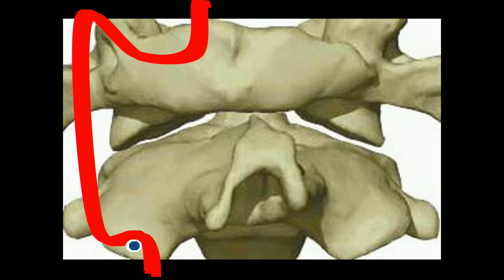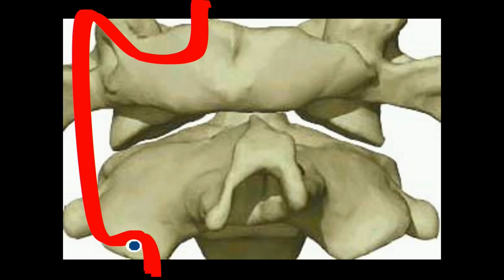That's the pars screw. Well, you're going to say, well, that pars screw is sitting right next to where the vertebral takes a turn before it goes into the foramen transversarium. And that is true. And the reason that the pars screw doesn't get you into trouble is because the trajectory is like 30 to 40 degrees superior. If you take a pars screw entry point and you go straight in, you will hit the vert.